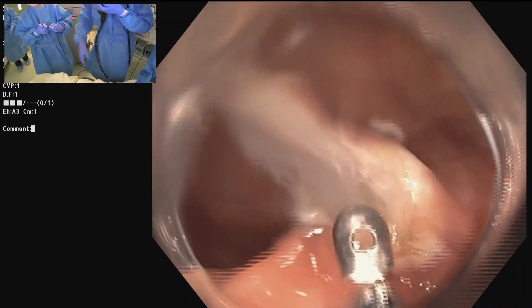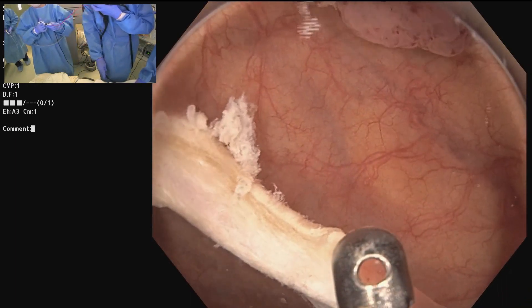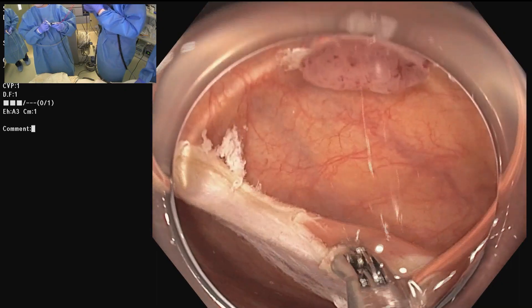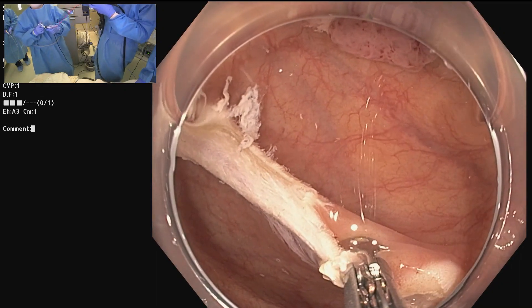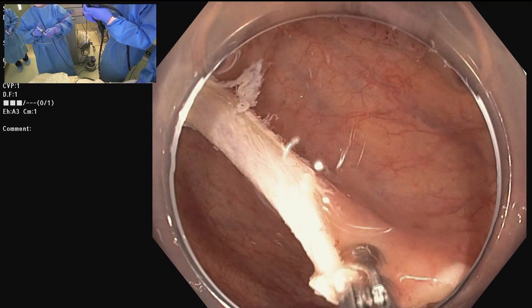Now you can see there's water — this is the water-gas interface, which is a pain. Let's do this underwater view then close. That's why I do everything underwater; you have to deal with replacing the water with gas.